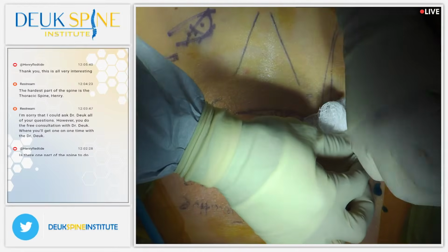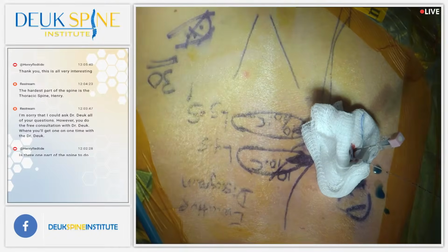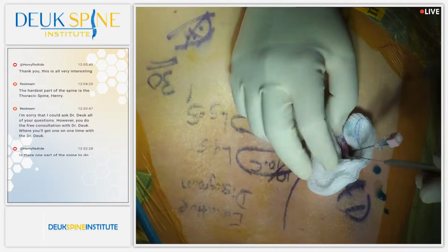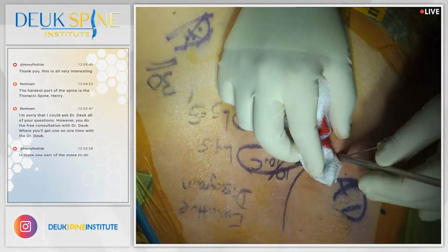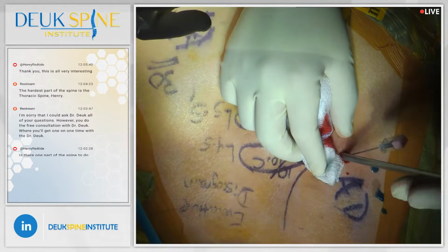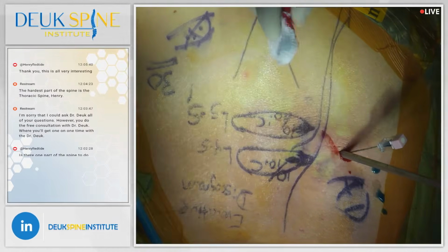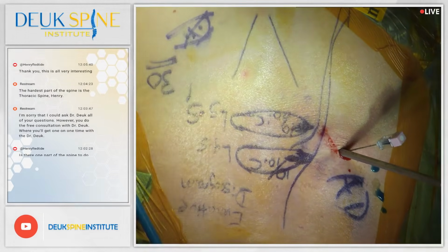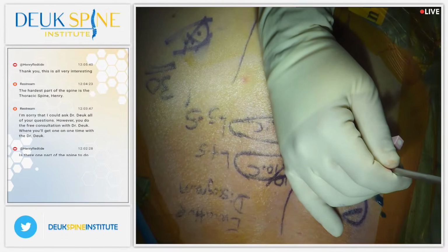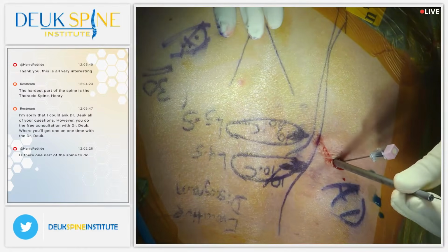You're okay. That's medicine going in your vein, that's all. You're doing great. I want you to count out loud from 1 to 100. She asleep? All right, she's back asleep. We're going to put a little numbing medicine in there just to numb up the fascia, because fascia does have pain fibers. Let me know if I can proceed.